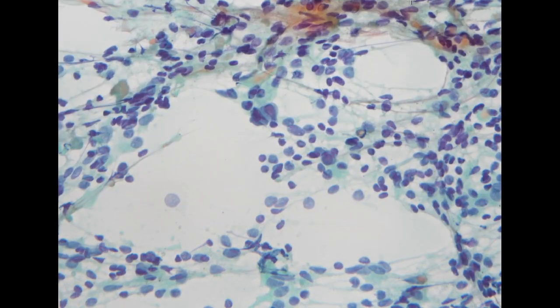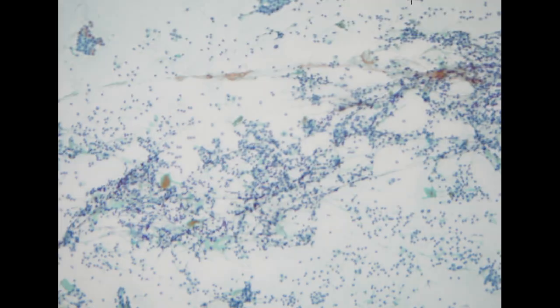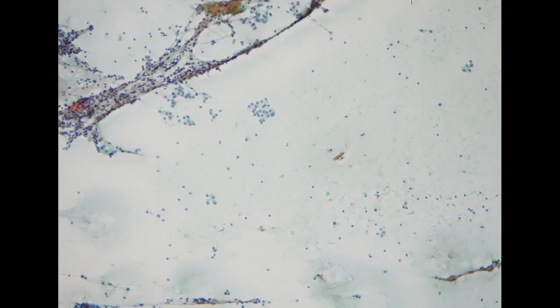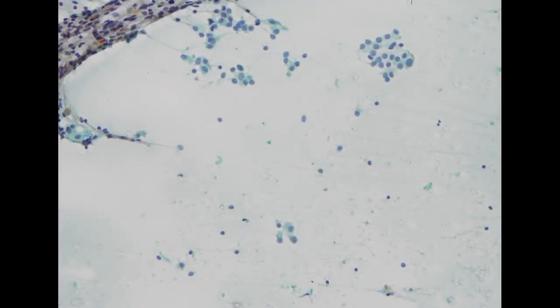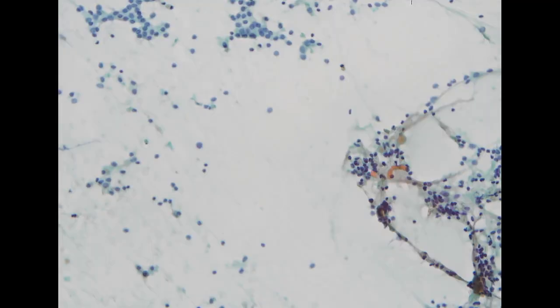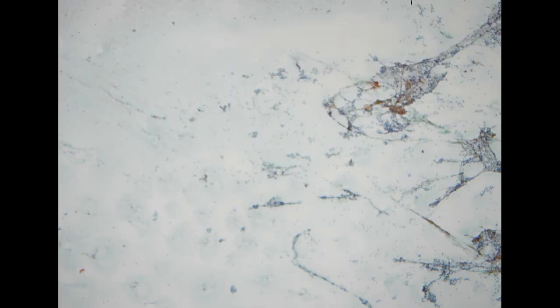Okay, so here you do have the papillary architecture on the direct smear. Let's see if we can find some pseudo inclusion. Sometimes it's not very easy. Yeah, but overall, the case is diagnostic for papillary thyroid carcinoma.